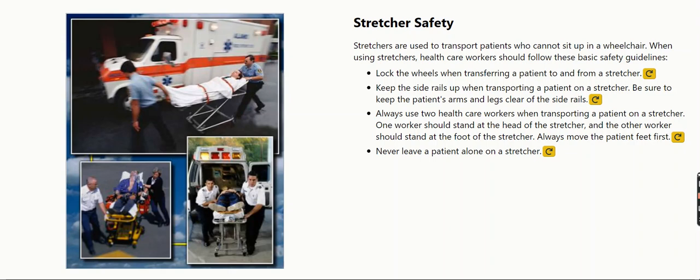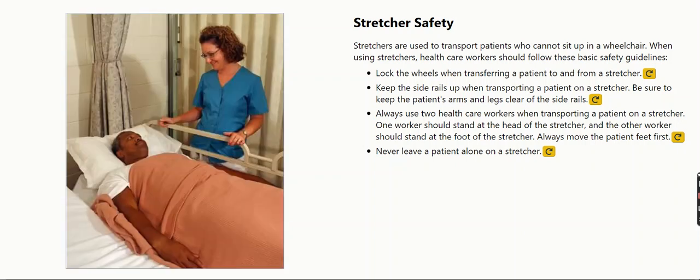Always use two health care workers when transporting a patient on a stretcher. One worker should stand at the head of the stretcher, and the other worker should stand at the foot of the stretcher. Always move the patient feet first. Never leave a patient alone on a stretcher.